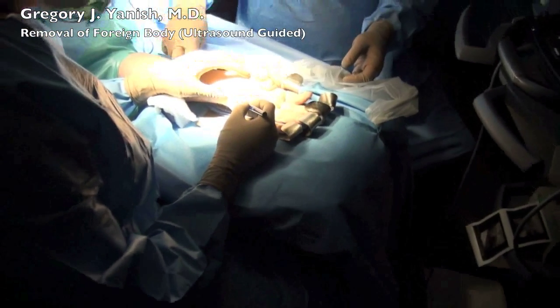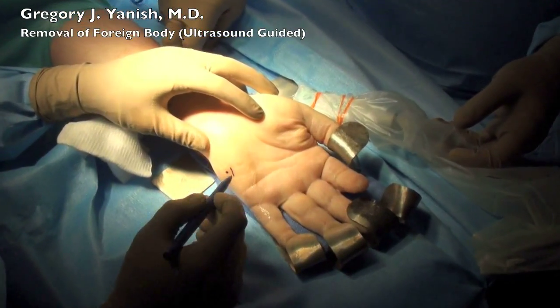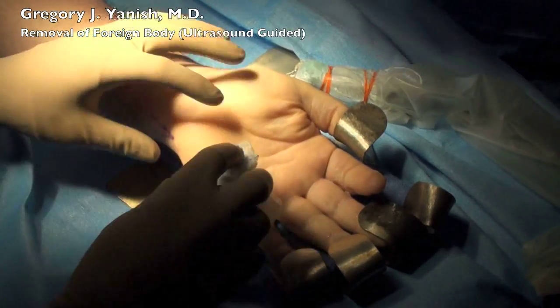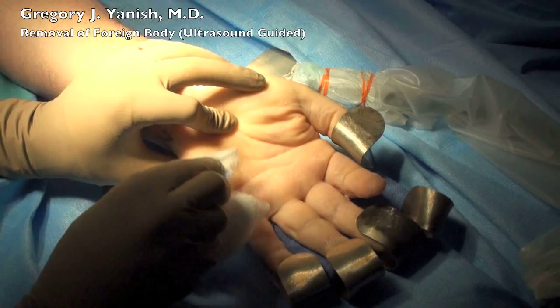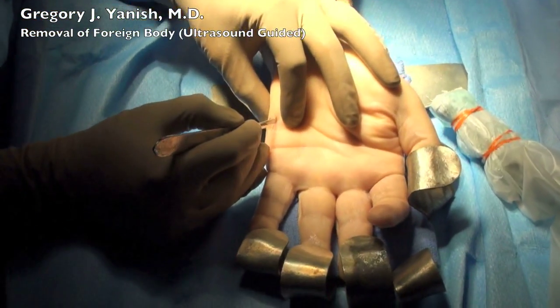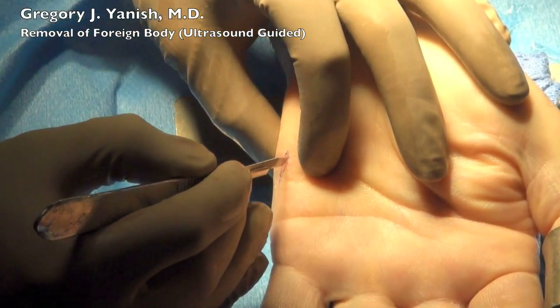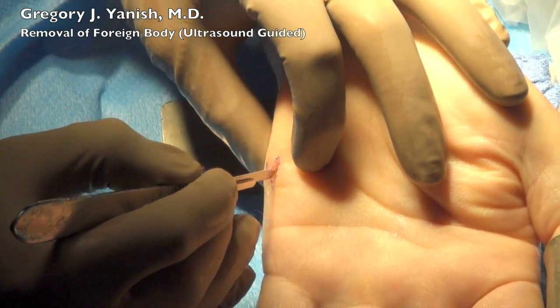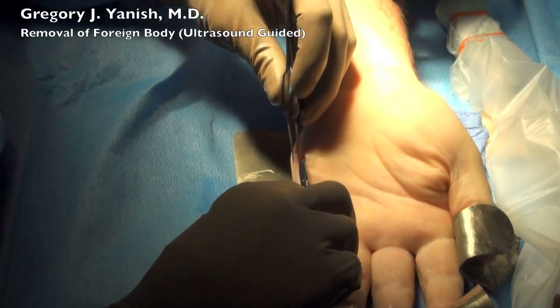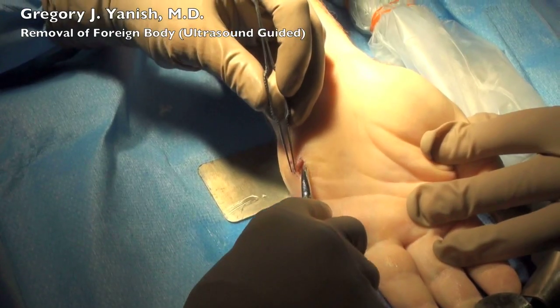We mark this location in two different planes, and that's done with a surgical skin marker. And then this allows us to make an incision precisely over the foreign body. The skin is incised with a 15-blade scalpel.